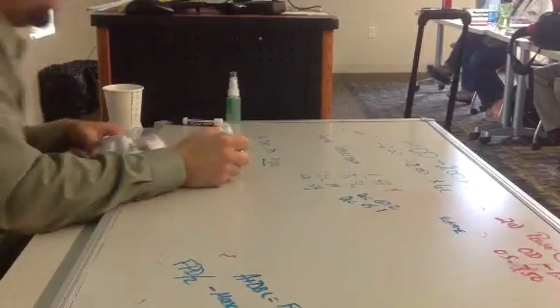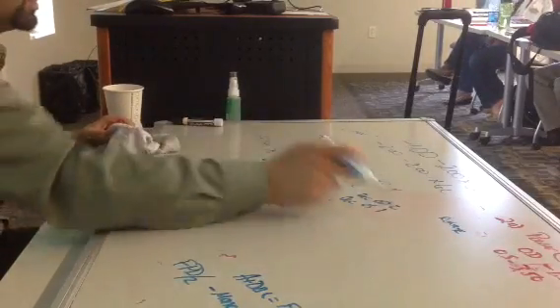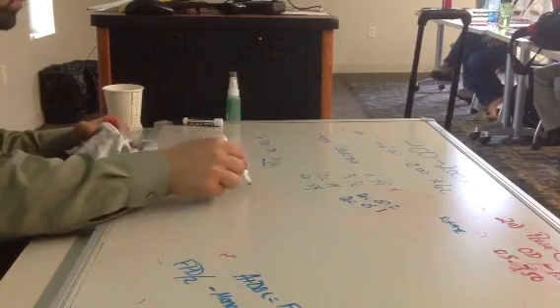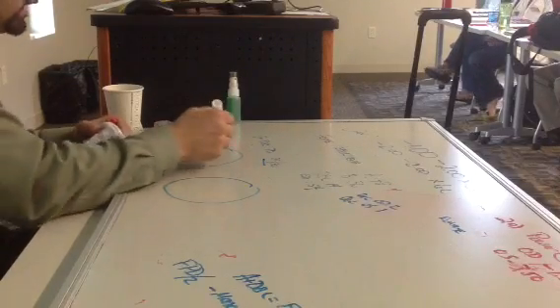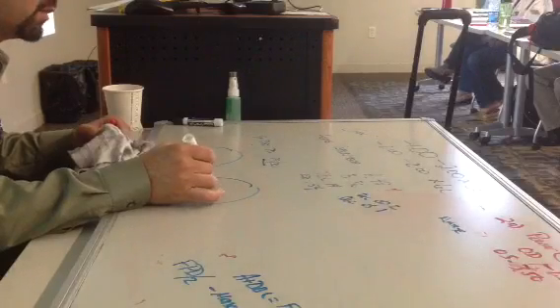So now, let's say, for argument's sake, we said the lab tech decentered it twice what they should have. Well, instead of going 2 in the right eye, and 1 in the left, they went 4 in the right eye, which was 2 too many. And they went 2 in the left eye, which was 1 too many.